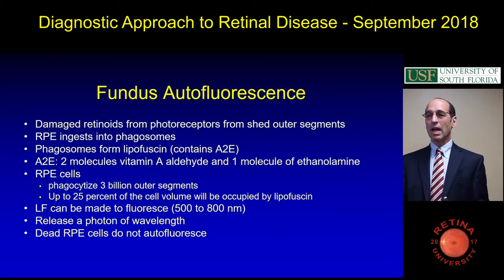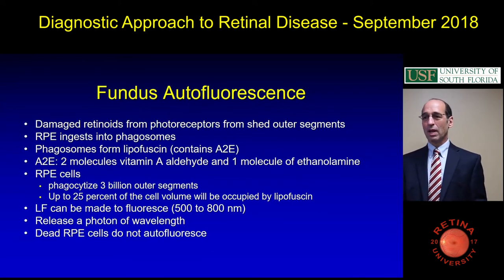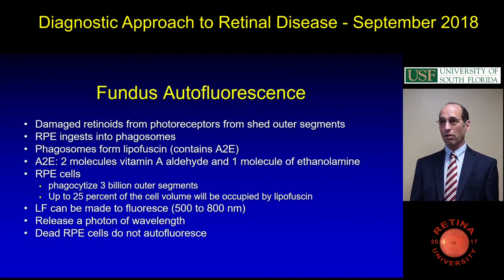digestion they're doing. And as you get older, up to 25% of your cells are full of lipofuscin. So that's normal aging. And lipofuscin will autofluoresce. So you hit it with the light. And then the thing to remember is dead cells don't autofluoresce.